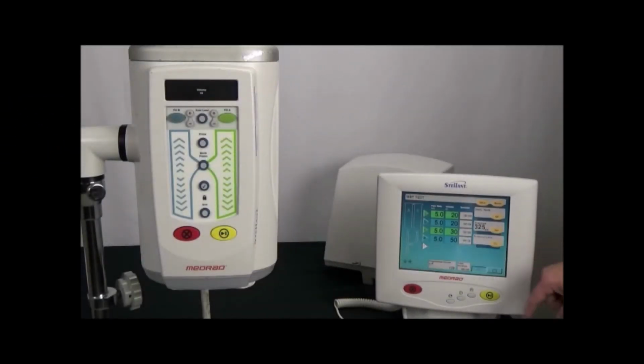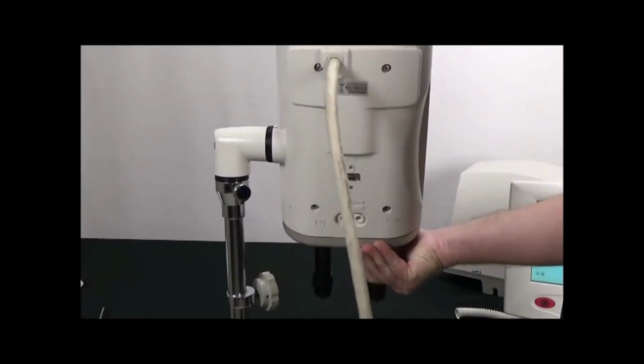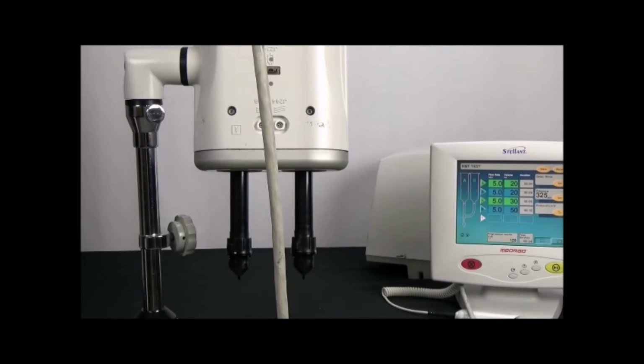Touch the Continue button to proceed to the main screen on the display. Tilt the injector head down. The pistons should already be fully extended. If they aren't, using the forward buttons on the injector head, extend them all the way out.